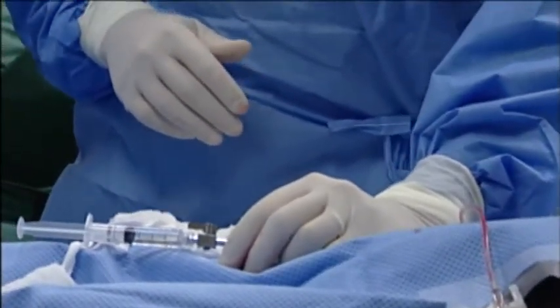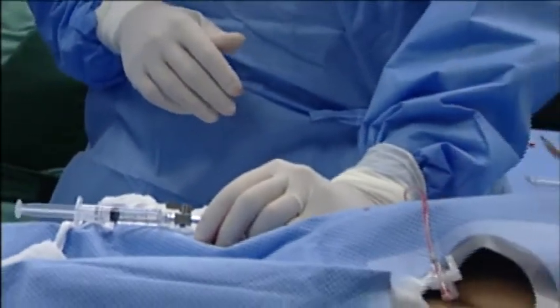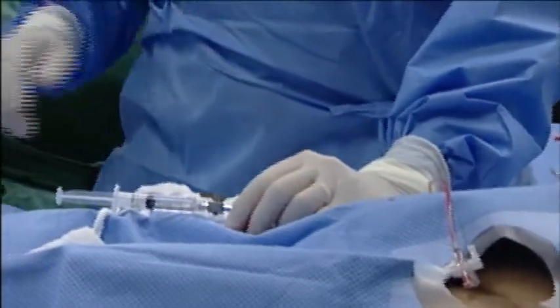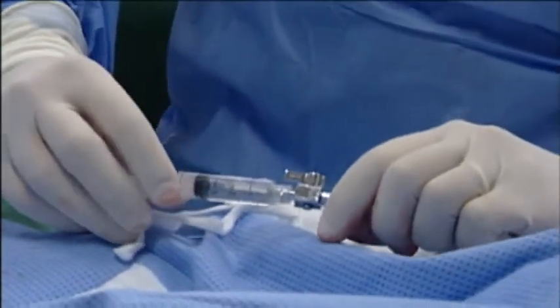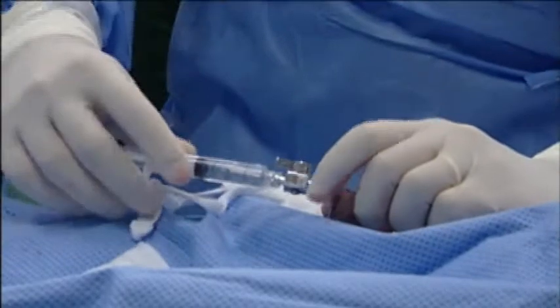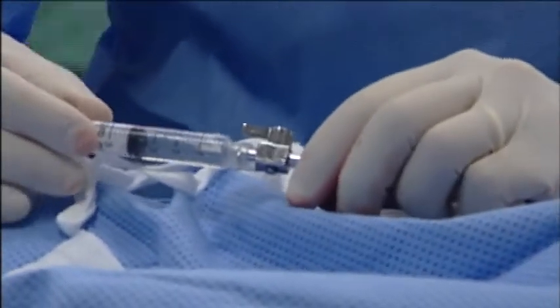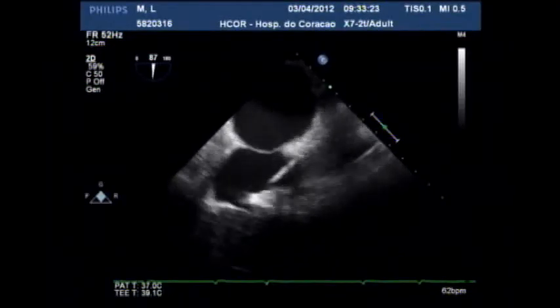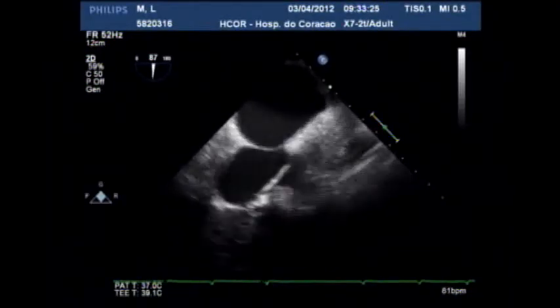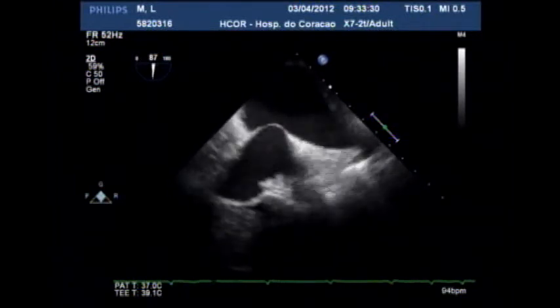I have the sheath in the SVC right now. I'm going to bring everything back, okay, fluoroscopy. So keeping the pointer here towards the 3 to 5 o'clock position. Let me see on echo. Echo made our life much, much easier. So we're going to see it's going to come down there. So let's see the echo.